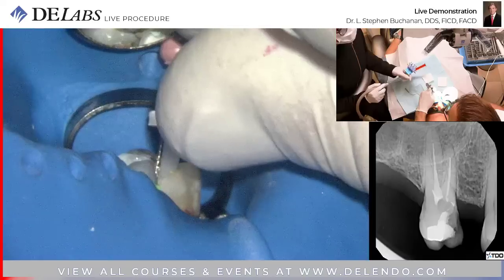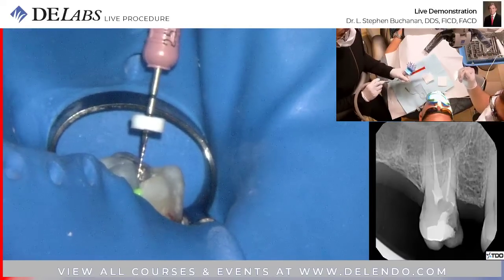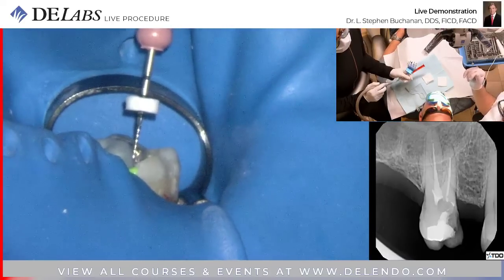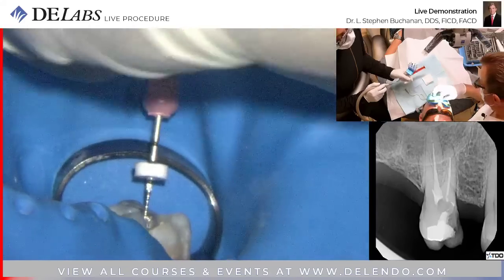So the deal that we started discussing earlier today, the way we're going to avoid blockage is always have a small enough file first there, either a square K file, an 08 in small canals, a 10 in larger canals, or you can get away with a triangular 15.